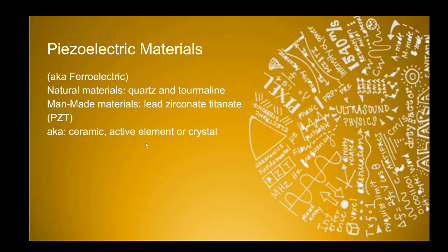So along the face of the transducer, we have these man-made materials, these PZT crystals, that interact with electricity from the machine and put out sound, and then interact with the reflections coming back to make electricity that gets sent back to the machine for processing.